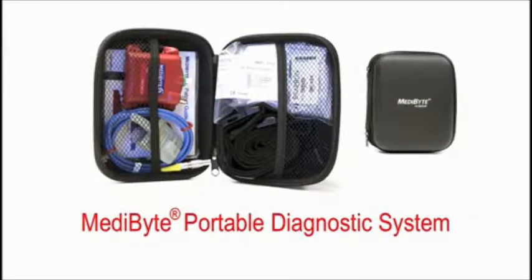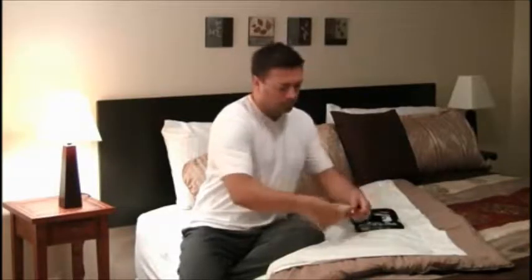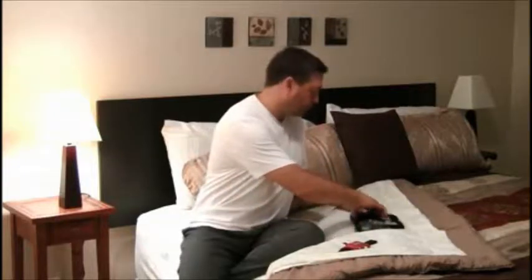The MediByte Portable Diagnostic System is an easy-to-use device that enables you to perform a sleep study. First, open the case and remove the adjustable effort belt and MediByte unit from the case.